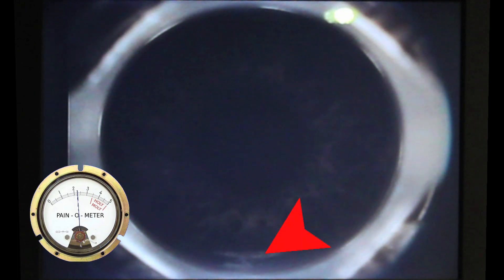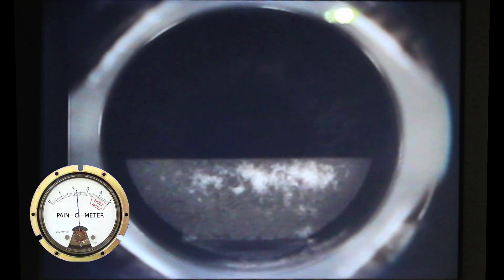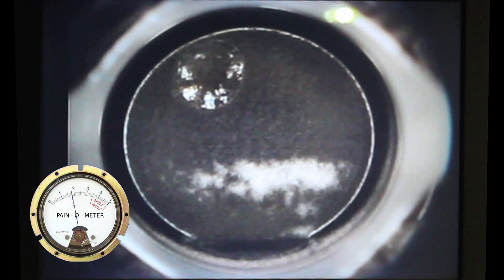Well, here the flap starts. You'll notice the laser cuts a flap, but it has a little anchor tab at the top here. It doesn't cut all the way through, but then the laser cuts all the way across your eye. Is that rad or what? So it's a three dimensional cut. So it's cutting like a hemisphere. And then once it cuts the whole tab, then it sears the edge right here. Isn't that awesome? That's the coolest thing in the world.